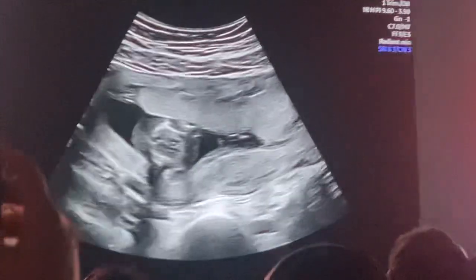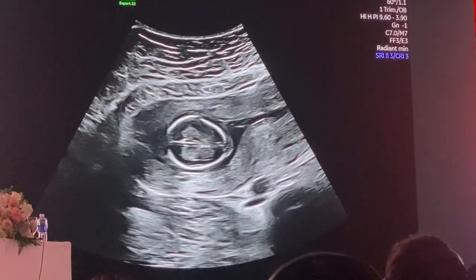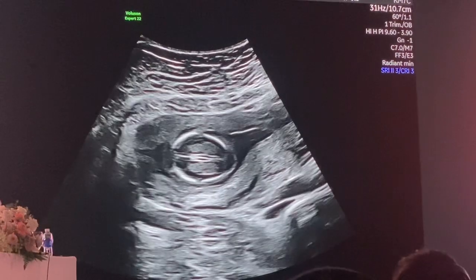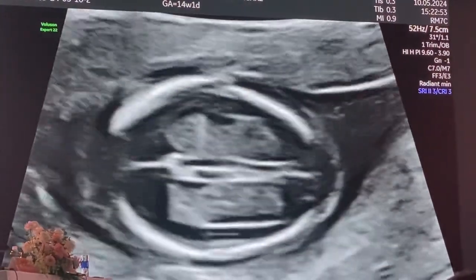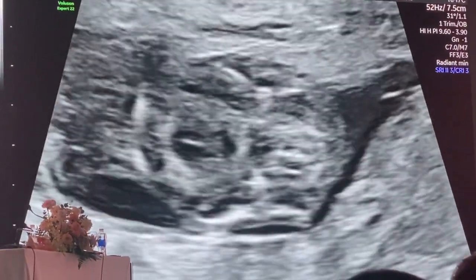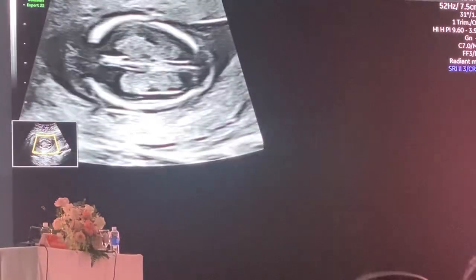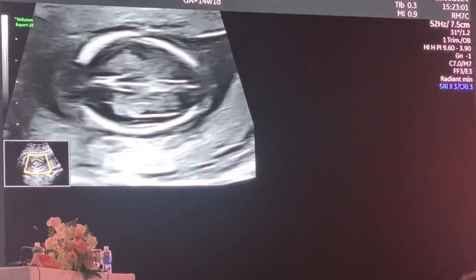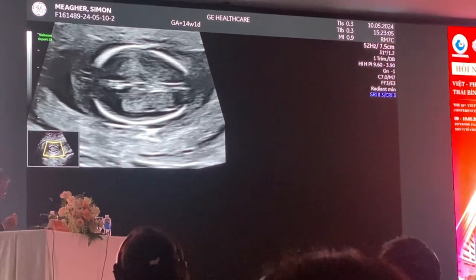Now I'm going to come down to looking at the fetal head. First of all, I can see that there's some subcutaneous edema. So I'm going to magnify the image of the baby's head, and I'm going to take a 4-segment analysis. I'm going to do this before I do my biometry, because I can see my crown-rump length is going to be difficult to get.